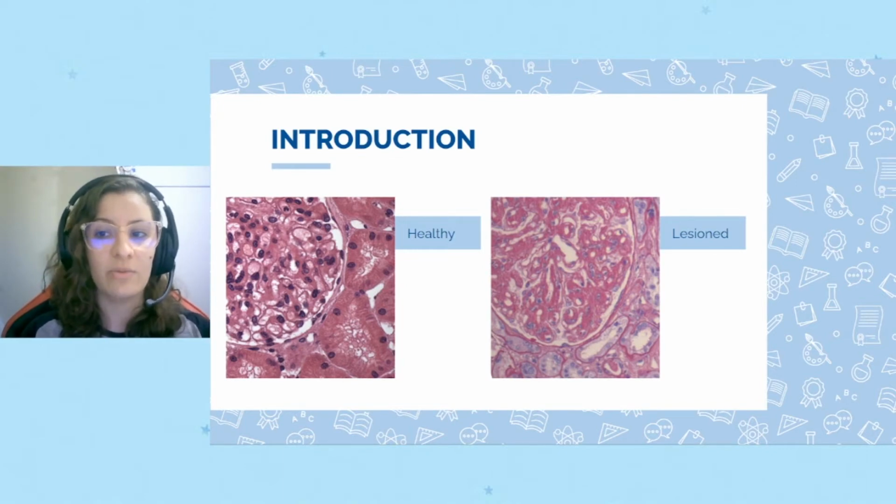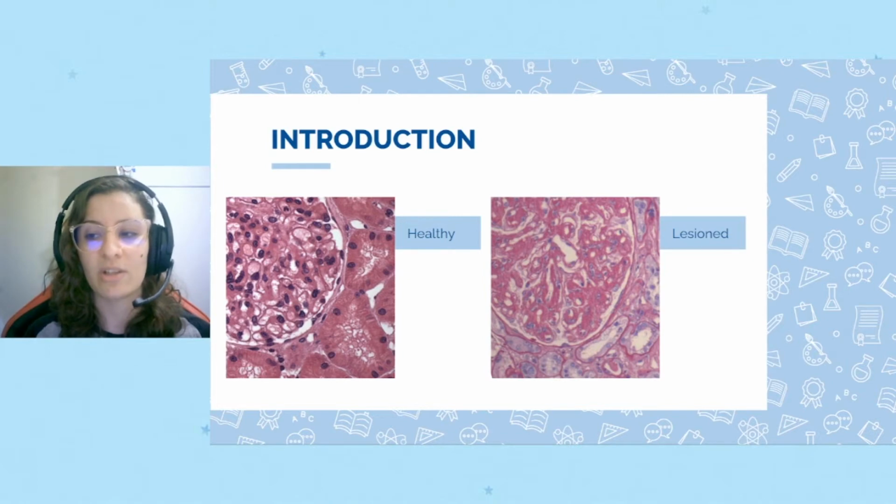Having this in mind, we initiated the development of PathoSpotter Search, a CBIR system designed to be part of the PathoSpotter project. This project is dedicated to creating tools and knowledge for aiding the diagnosis and facilitating other tasks in nephropathology, such as annotation of structures in whole slide images and retrieval of similar cases based on images of glomeruli.